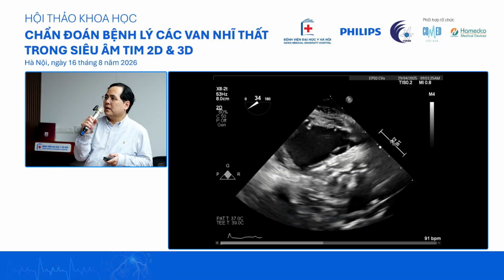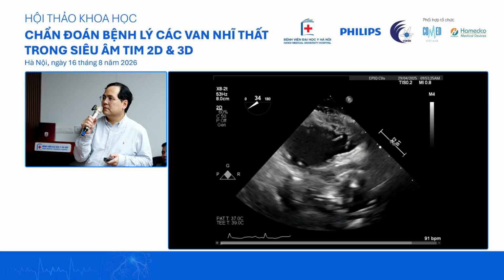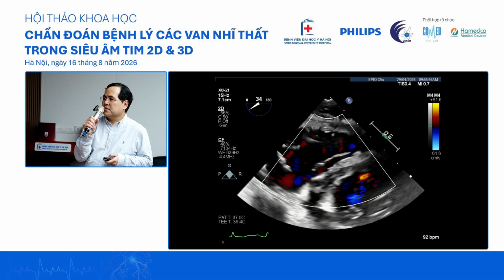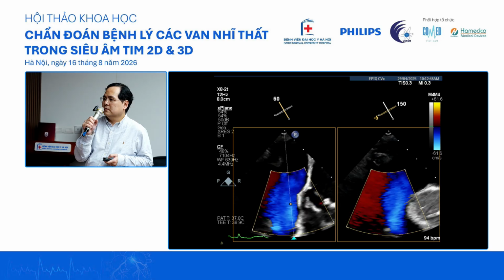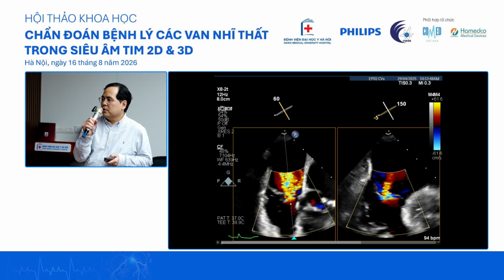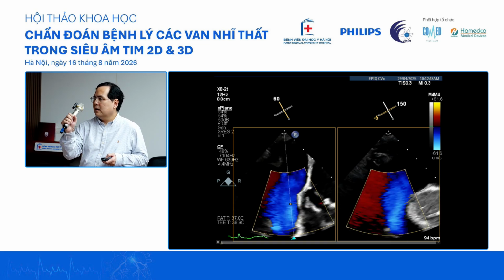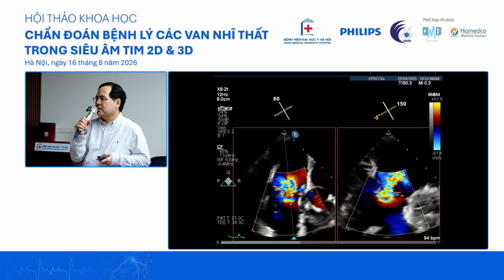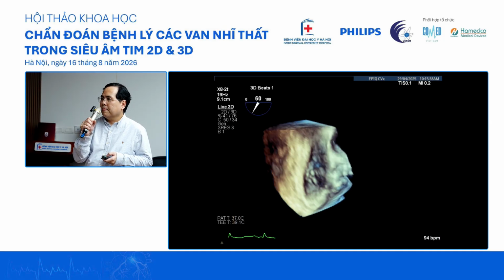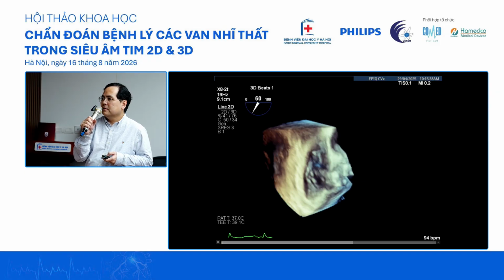Then you do transgastric, you can get septal on the top, anterior on the bottom, posterior on the side. So then there's tricuspid regurgitation between the leaflets. Then if you want to do a short axis, you can see the anterior leaflet on the right hand side, and then the posterior leaflet on the left hand side. And with three-dimensional, you can reconstruct from the planes. Okay. As you can see, there's malcoaptation between all the leaflets.